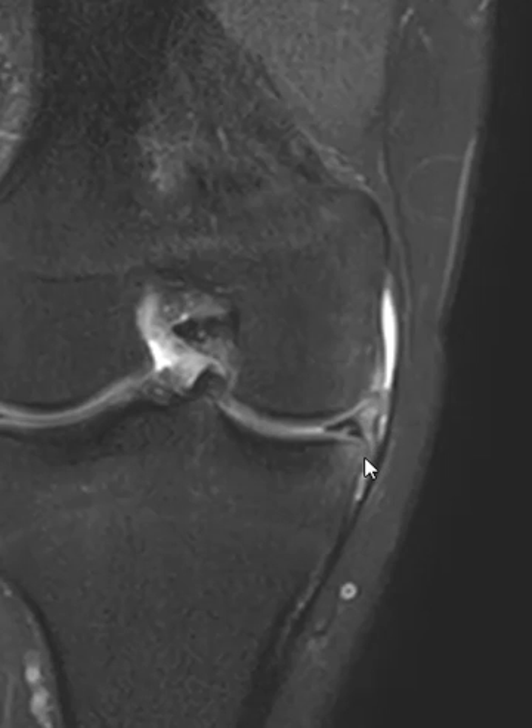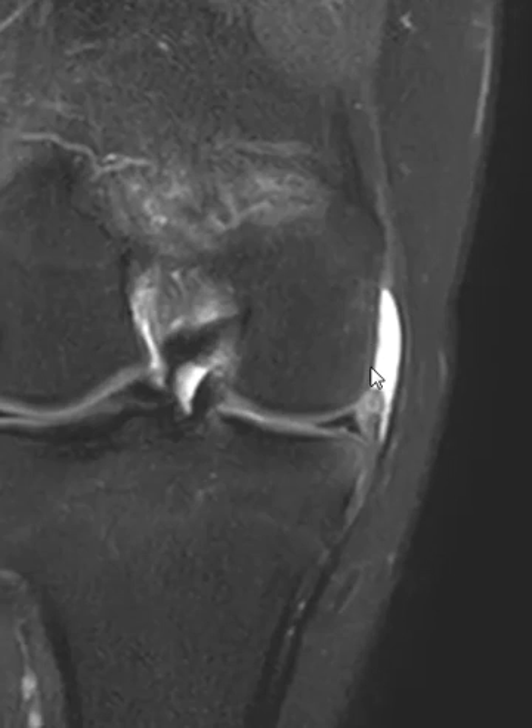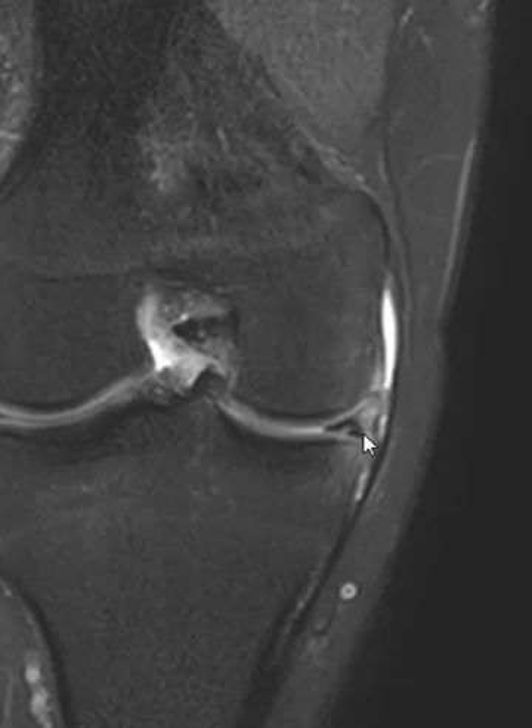The other thing we notice is that there is a medial meniscus capsular junction injury. The meniscus body here typically is adherent to the inner capsular fibers, and there's no gap or space right here. But in this case, the inner capsular fibers are torn and pulled away from the femoral condyle, and they're thickened. There's also this gap between the peripheral rim or the capsular surface of the medial meniscus and the fibers. So we call this a medial meniscus capsular junction tear with a separation.